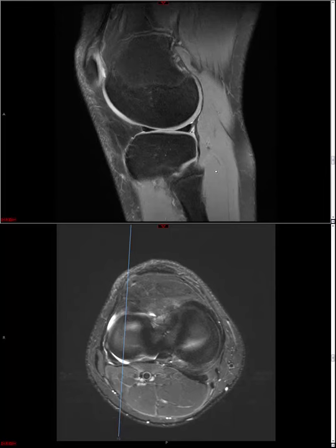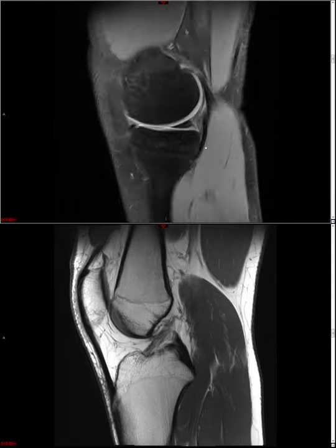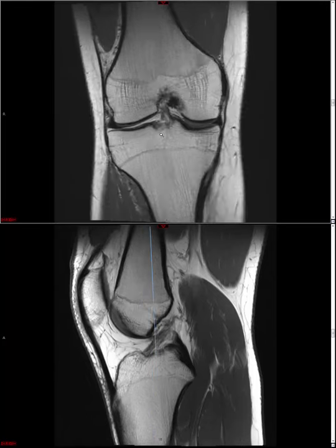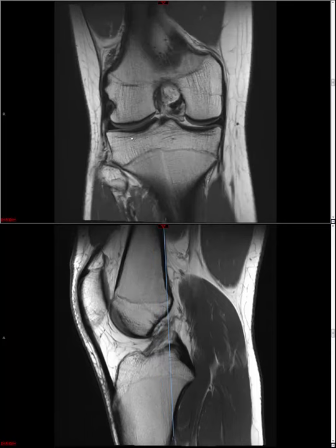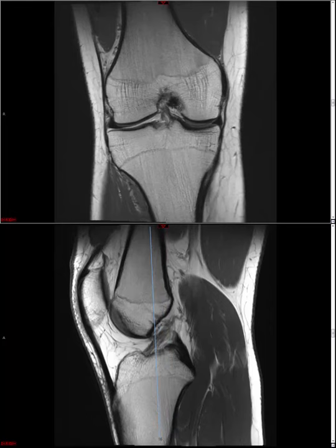So the normal MR appearance of menisci is that of homogeneous low signal. You should see nice, well-defined sharp triangles here corresponding to the anterior and posterior horns of the lateral meniscus, and if we scroll to the other side, anterior and posterior horns of the medial meniscus. If we go to our coronal sequence, likewise, we should see nice dark triangles corresponding to the bodies of each meniscus. So how do we diagnose a meniscal tear?